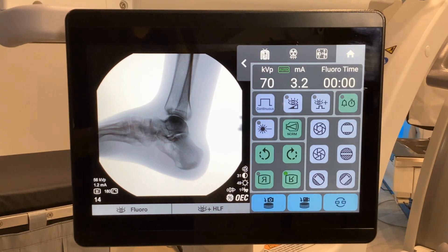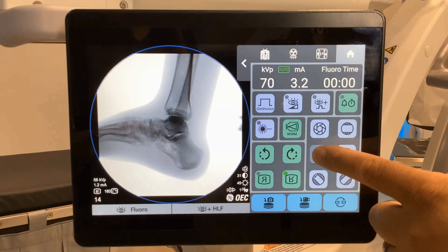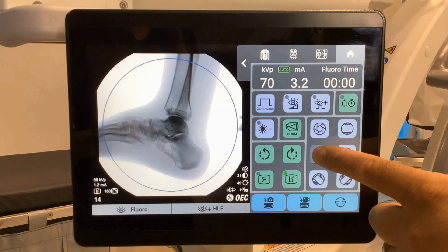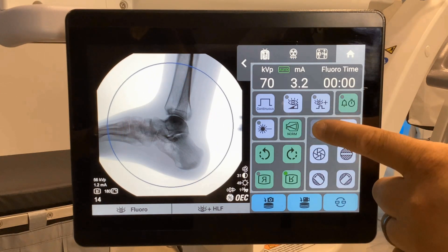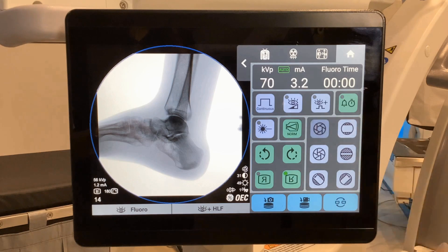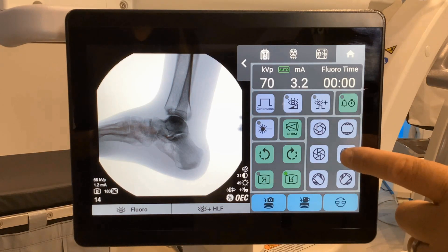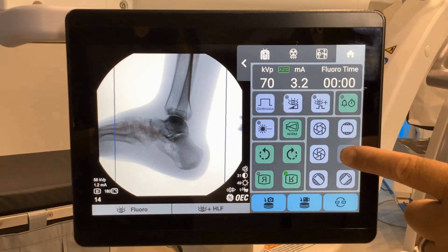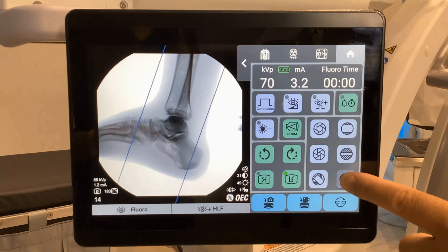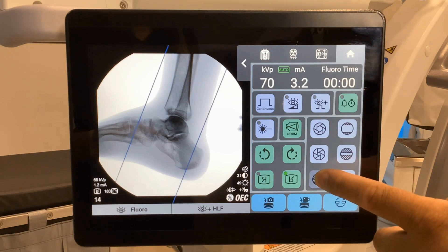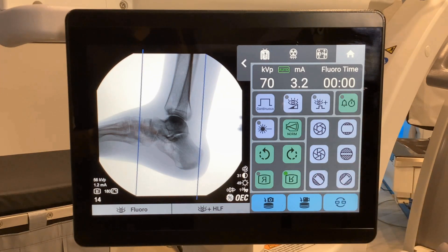Collimation. We have two different options for collimation. The first is iris collimation — close and open. Notice the preview lines. We also have shutter collimation — close. Notice the rotation options underneath, and open.